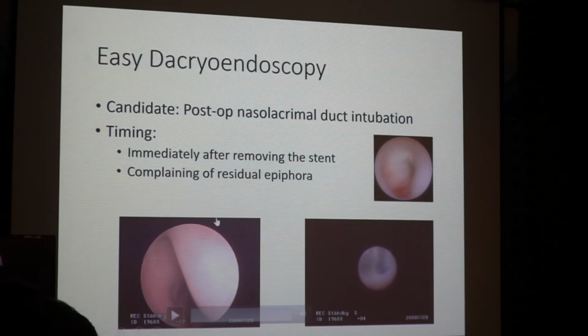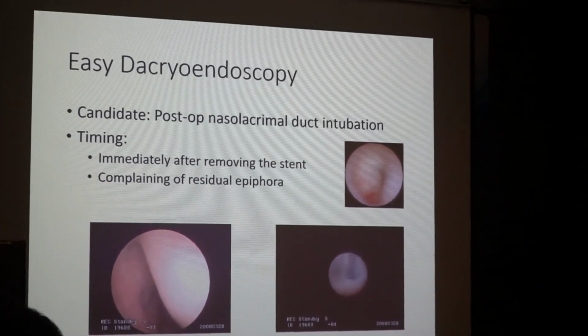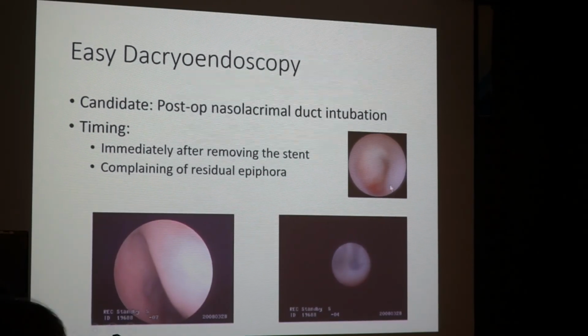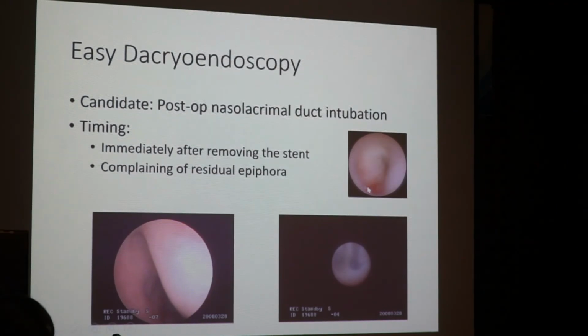So look at this. The examination timing is immediately after removing the stent, and when the patient is complaining of residual epiphora, then you can go for dacryoendoscopy. Immediately after removing the lacrimal stent, often you can see this kind of granulation formation inside the lacrimal passage because of irritation or allergic reaction to the lacrimal stent. 20% or 30% of patients show this kind of granulation.